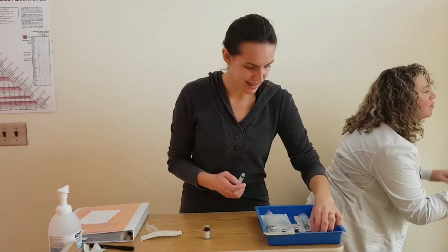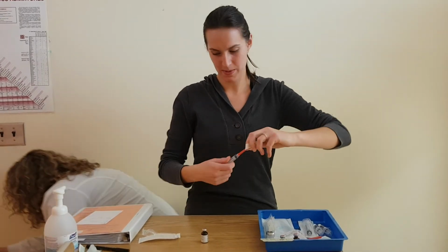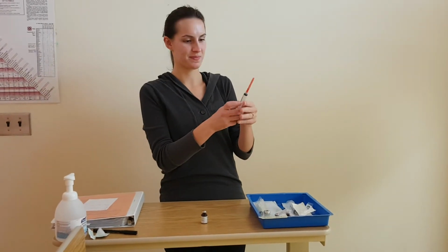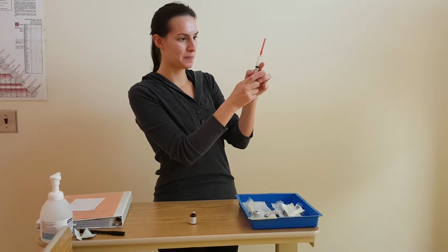So now that my vial has dried, I'm preparing my syringe here. So I'm going to inject 4 milliliters of air. I'm just going to go over my MAR.